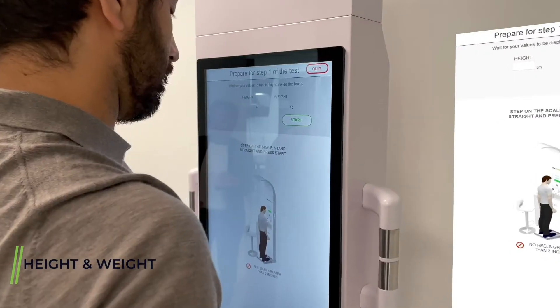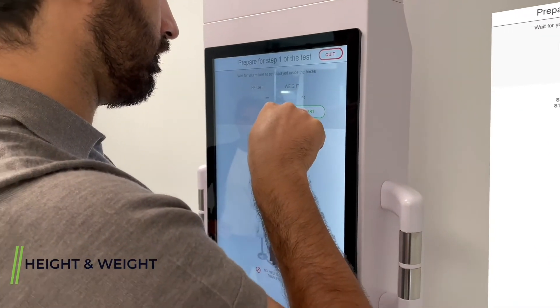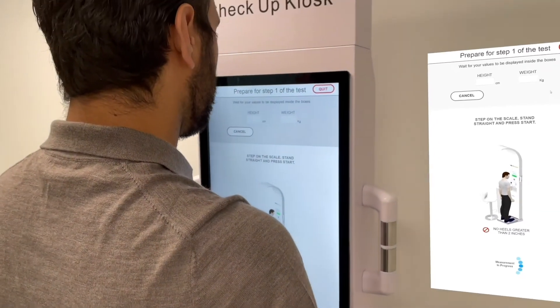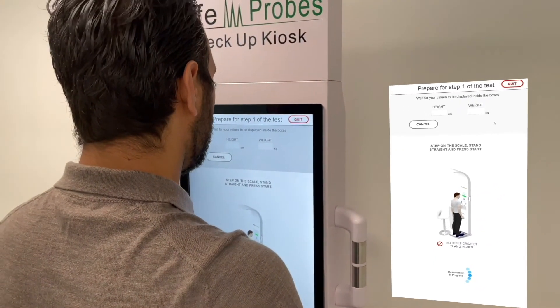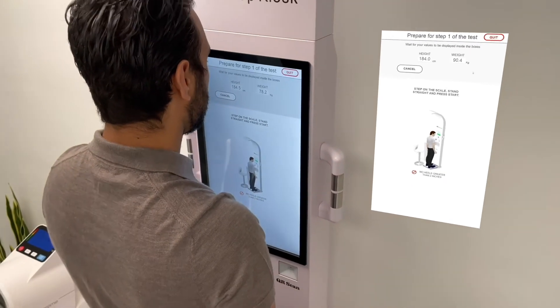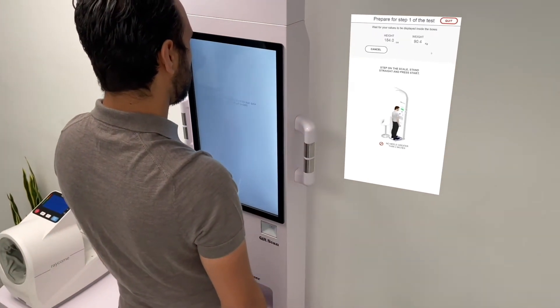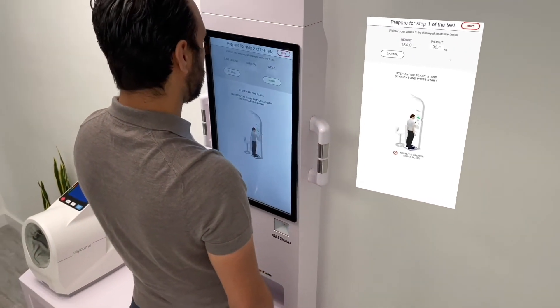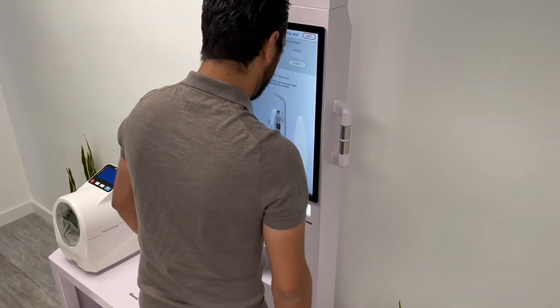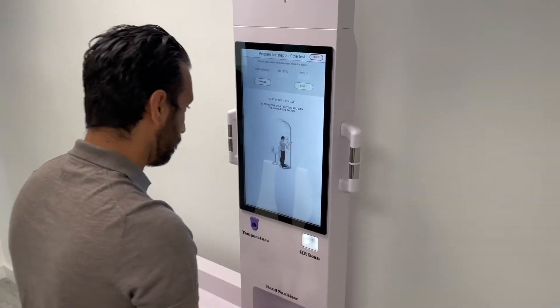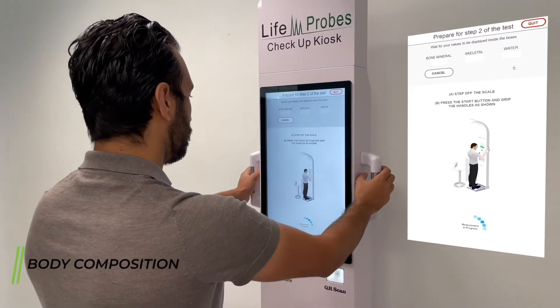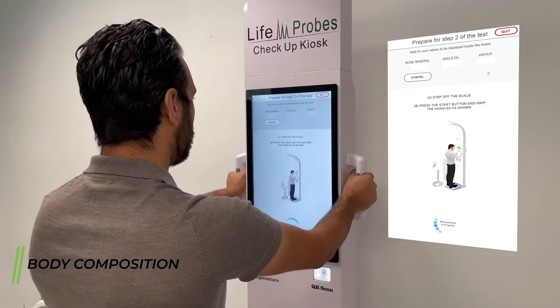Phase one of the exam: height and weight measurement. Stand on the scale, press the start button, and stand straight. Wait for the results to show on the screen. The measurement is complete.